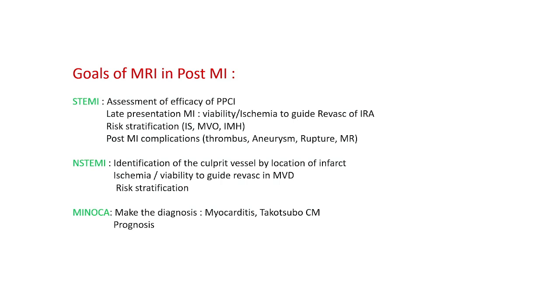In non-STEMI, most of the time, angiographically, you cannot detect the culprit artery because there is almost always multivessel disease. In that sense, MRI can detect which area is infarcted. And in MINOCA, I mean myocardial injury with normal coronary arteries, an ACS-like syndrome, MRI can detect whether it is myocarditis or myocardial infarction or Takotsubo or vasospastic infarction.